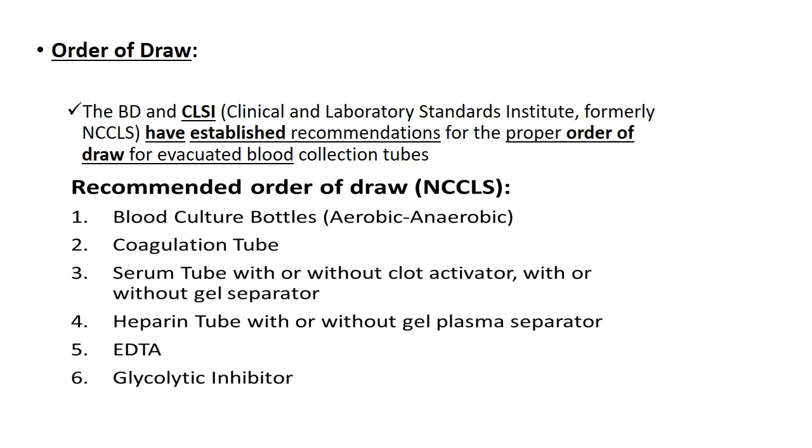Third is the serum tube, that is the gel tube, where you will take biochemistry. Then there is heparin, then EDTA, and lastly fluoride. Why fluoride last? Because if there is fluoride contamination, fluoride may falsely inhibit the action of enzymes like urease, etc., which may impact the biochemistry result. So at last fluoride, and before that EDTA.